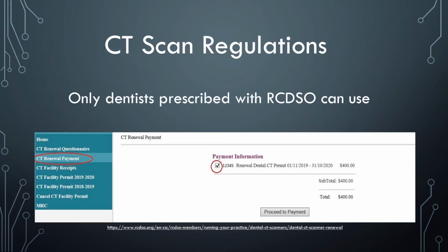Only dentists are able to prescribe, order, and take dental CT scans and must register at the RCDSO. Dentists who want to install and operate a scanner in their facility must obtain a permit and renew it annually.